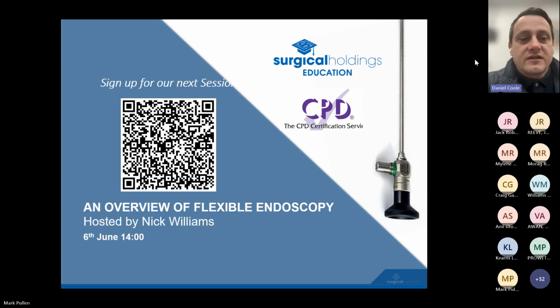Most common brands, really, I would say, Mark. Tim's just made a comment around what's the most common fault we see with scopes. Did you want to pick that up, please? Yeah, I'd say it's probably one or two: either moisture ingress, moisture or fluid within the scope system, or broken rod lenses. So things from contact damage. If the scope's been hit with something or dropped, they're probably the most common repairs that we would see.